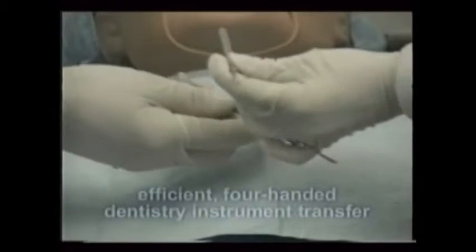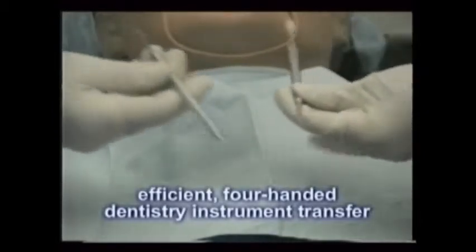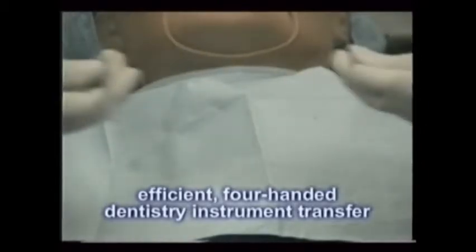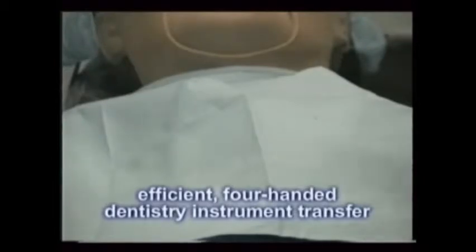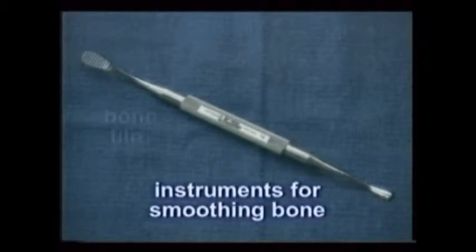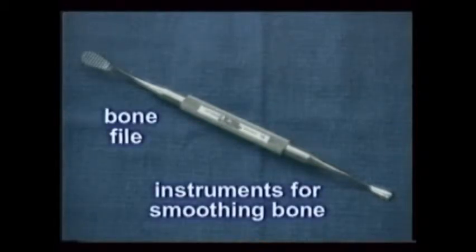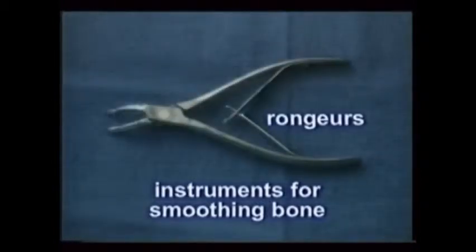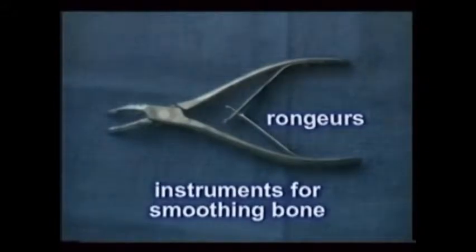Remember, efficient instrument transfer can help minimize treatment time and help maximize patient healing. Finally, any bone defects such as craters or sharp edges are reshaped. Sometimes, in the absence of any infection, a bone fill may also be needed. Both artificial bone fills and the patient's self-donated bone may be used.